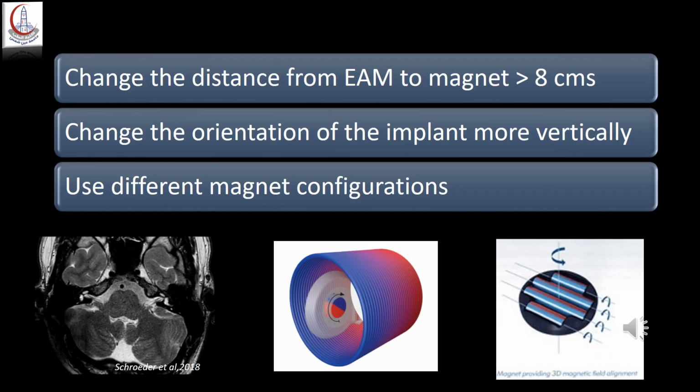As you know, more and more patients are being implanted. Pediatric patients have their whole lifespan in which they can be in need of an MRI, and older patients will definitely need an MRI for intracranial pathologies and so on and so forth. So we have to mitigate for this, and there are some tricks we can use when implanting the patients in order to minimize the effect of the presence of the magnet on head and neck imaging.